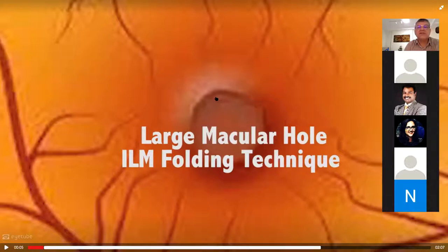I brought these views from my previous retinal fellows here in Brazil. I was telling them we should do more wide angle because we see the whole thing — it's better for tracking. But still, for macular work, we applied the macular lens to see it closer. Let me start the video.